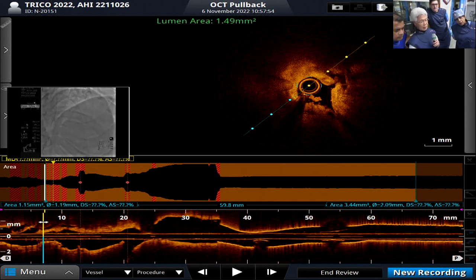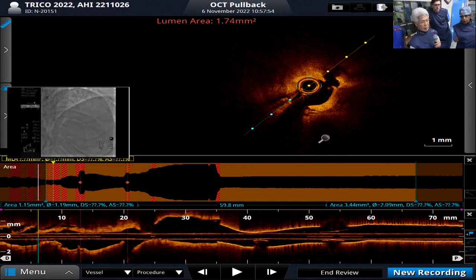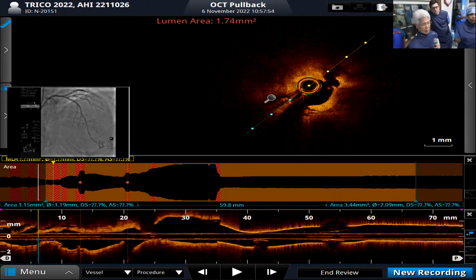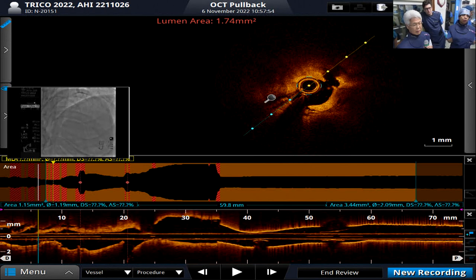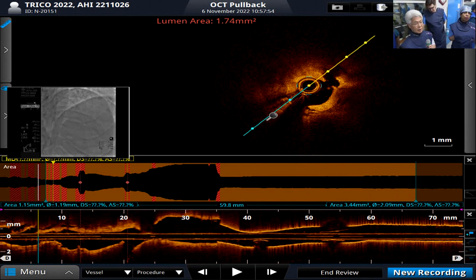I think to your point, that's part of the discussion around should you pre-dilate or should you just atherectomize from the start. Personally, as a reasonably heavy atherectomy user, I have no problems doing rotablation in a vessel that has got a dissection in it. Right, but you do have to be wise about how you do it. Here you don't need it.